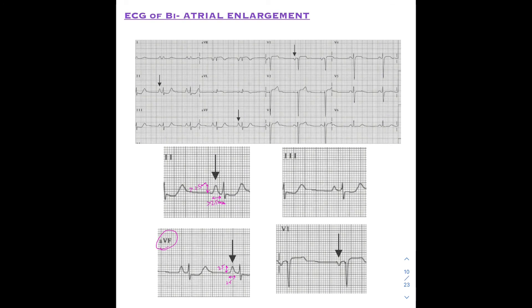In lead 3, the P wave appears normal — but that is fine, because the criteria are fulfilled by leads 2, aVF, and V1. In lead V1, the inverted P wave is almost 1 mm or more in both depth and duration, which is abnormal — normally it should be less than 1 mm. Together these findings confirm biatrial enlargement.